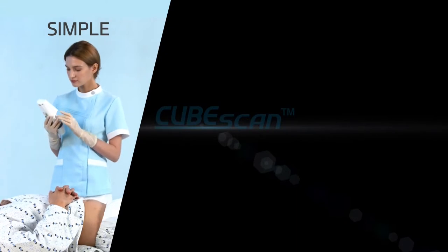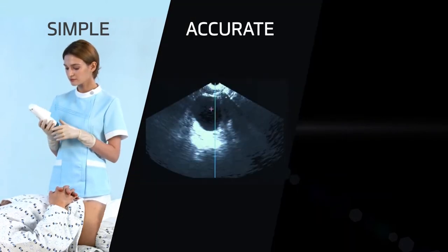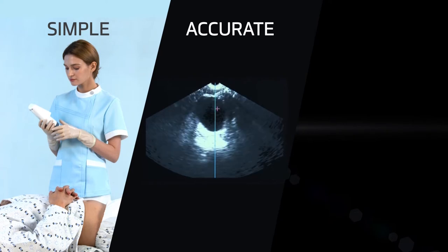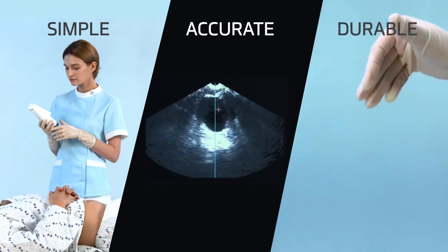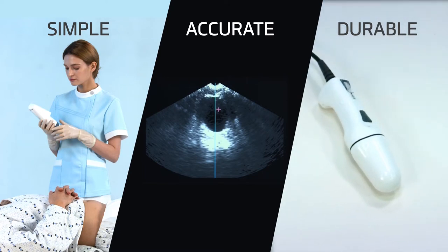Accurate scanning regardless of gender, age, and disease leads to quick and simple workflow. Industry-first live pre-scan imaging and bladder point targeting make it easier than ever to find the bladder.